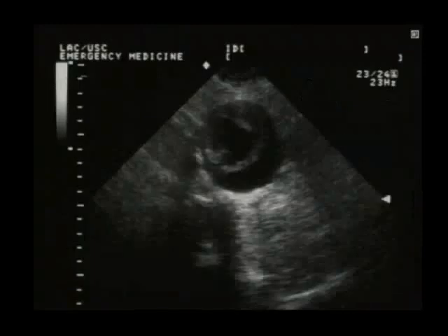Here's another patient with a large aneurysm. And this is not measured, but it's at least 5 centimeters or so. Now this patient actually has components of most likely a dissection as well. Now this is a different diagnosis, different pathology, obviously aortic pathology, but a different sort of pathogenesis. But we see a true lumen here. You see some thrombus here, but we see another lumen here. Okay, and I'll show you an example later of how you put color flow on, you can actually see 2 lumens.